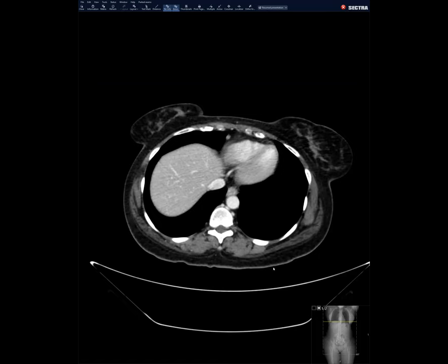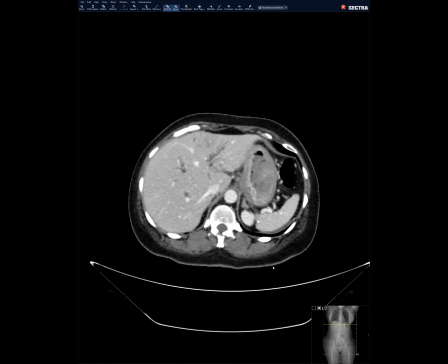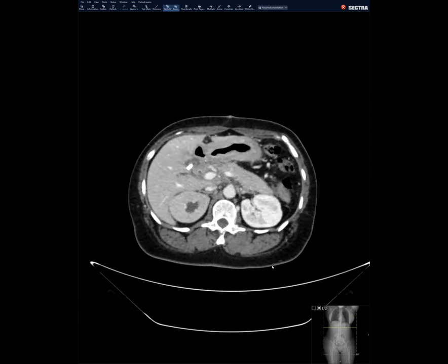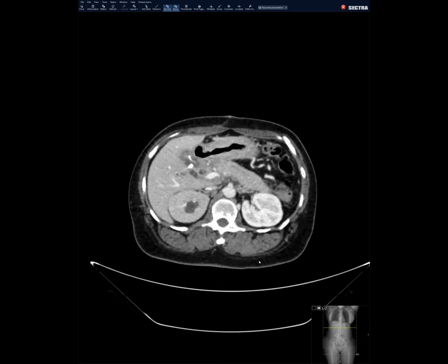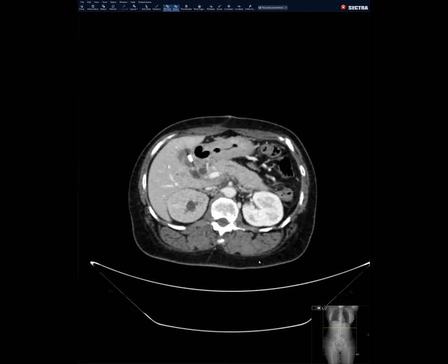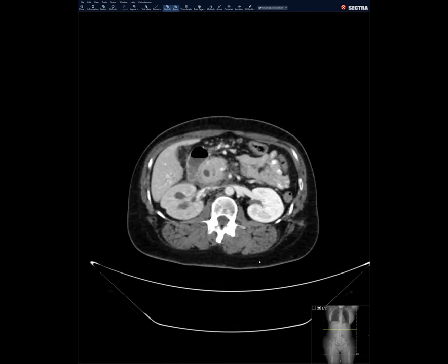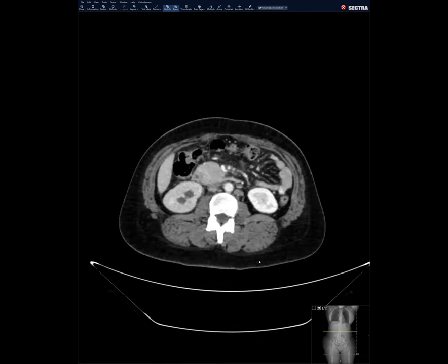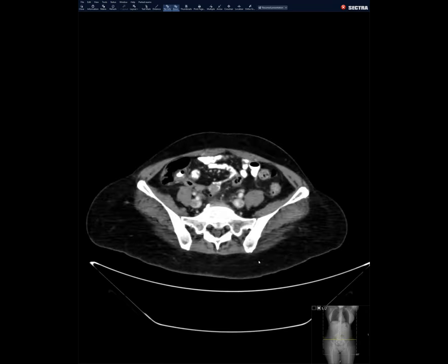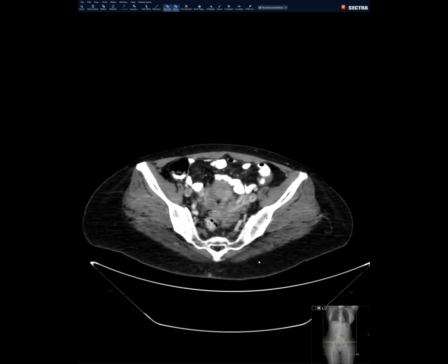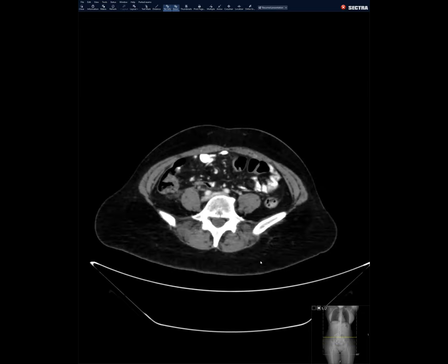Three weeks later she showed up in our ED with jaundice and abdominal pain. The findings are not hard to pick up, but I thought the histology on this was very interesting. There are a few findings in the pelvis and the majority of findings in the upper abdomen.